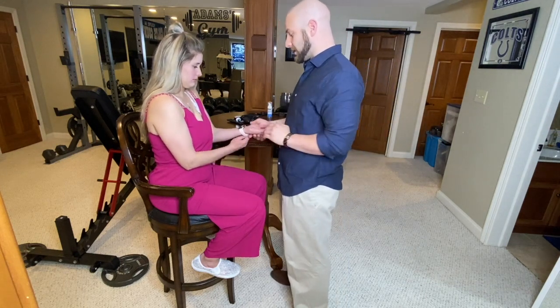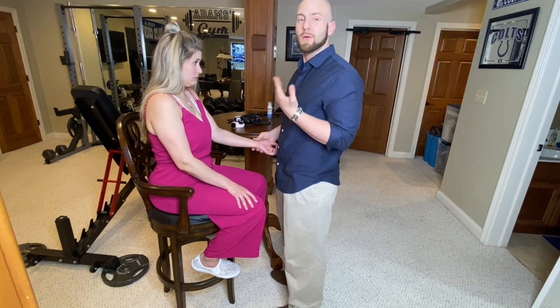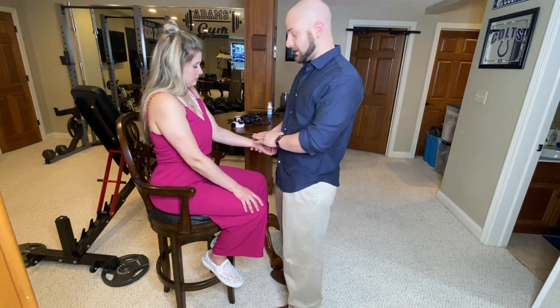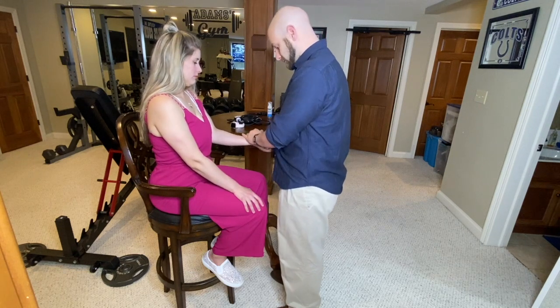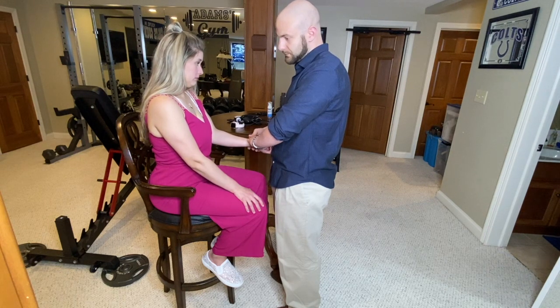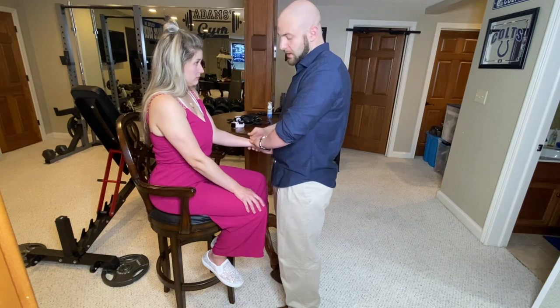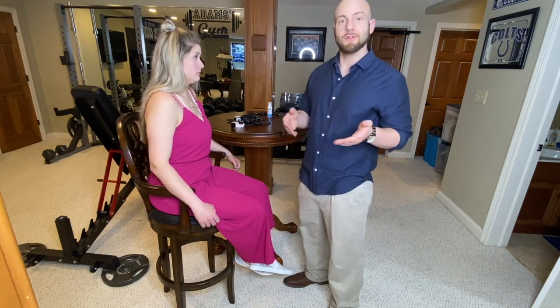Next, I'm going to check her other radial pulse. With this one, I'm also going to be checking her respirations per minute, because we don't want to let our patient know that we're checking for that. We don't want them to change their breathing, breathe too shallow or too deep, and change what they normally would breathe like. A normal breath rate for an adult would be 12 to 20 breaths per minute. Lindsay was at 8 breaths per 30 seconds, so if you double that up to 60 seconds, she would be at 16 breaths per minute, and a healthy range is 12 to 20, so she's in a good range.